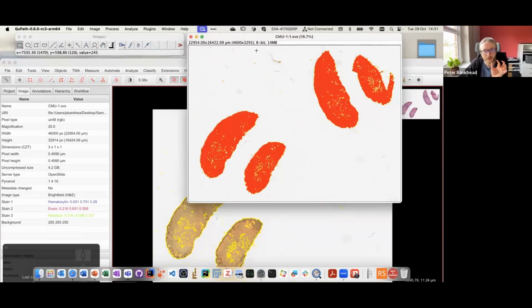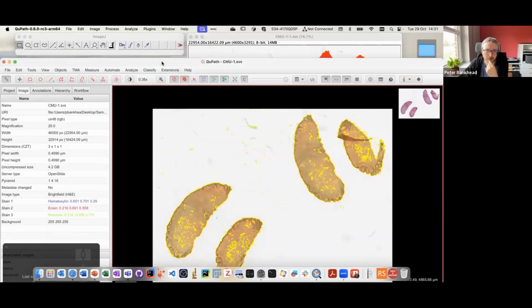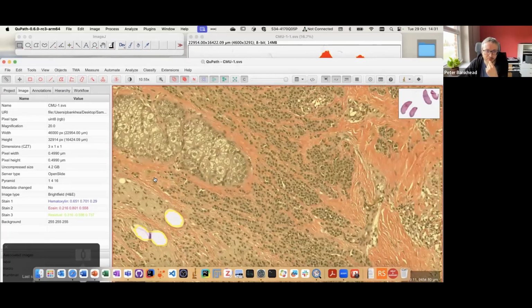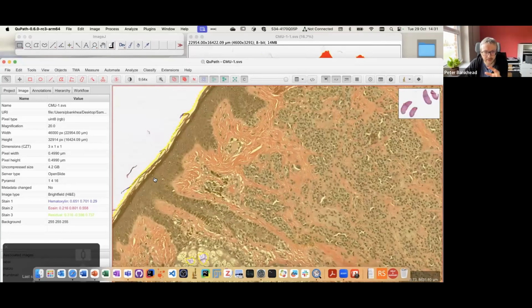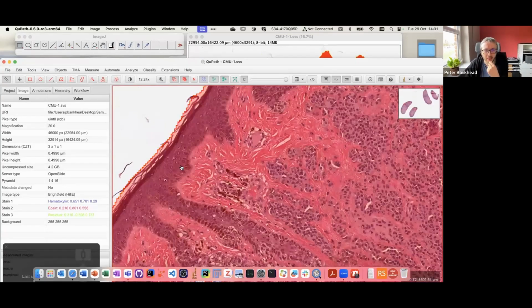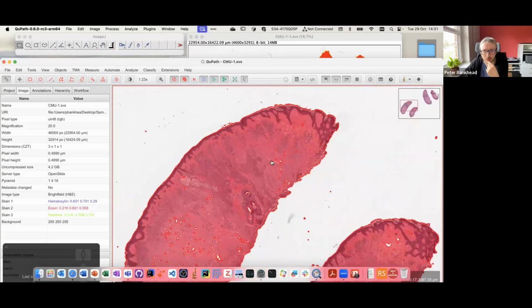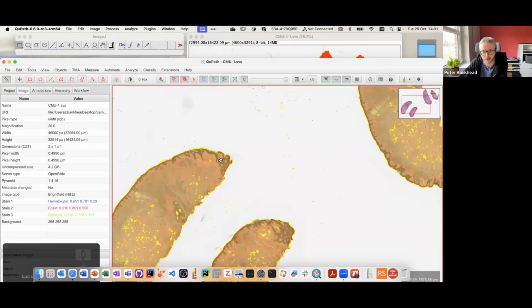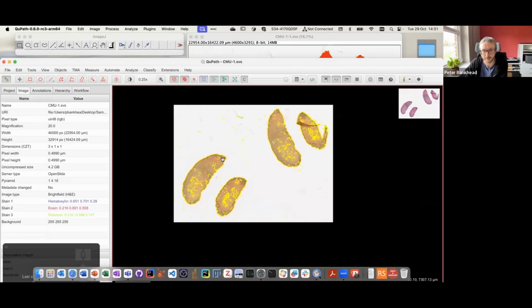So even though we extracted this image 10 times smaller in each dimension, and we generated all of our regions here, QuPath, whenever it's receiving this image back, is able to figure out exactly how much it needs to rescale. Then we can start to use ImageJ to generate regions at a lower resolution and send them back to QuPath. And so that's what we've done in here.